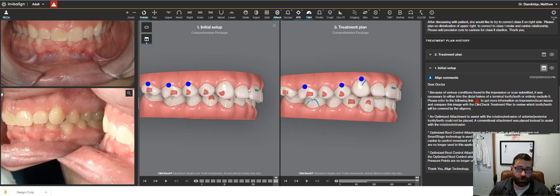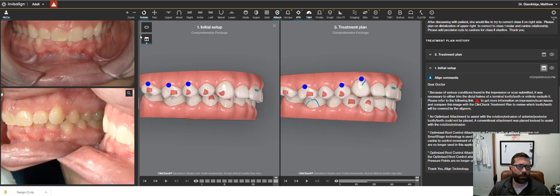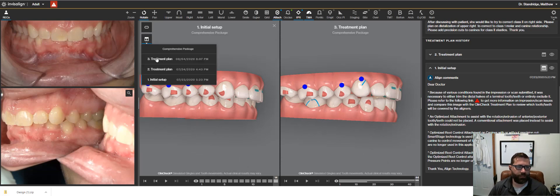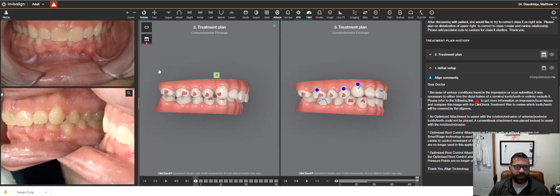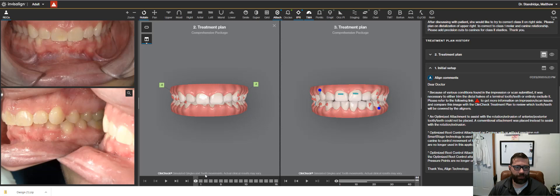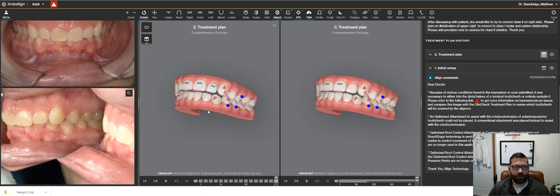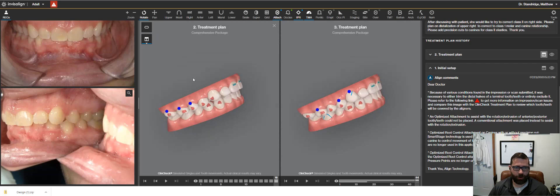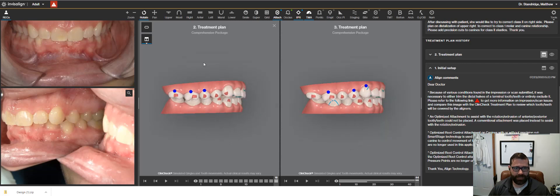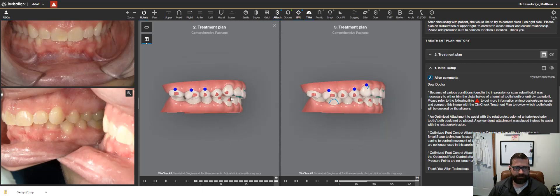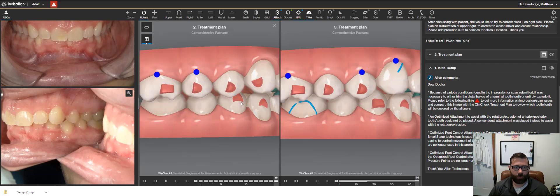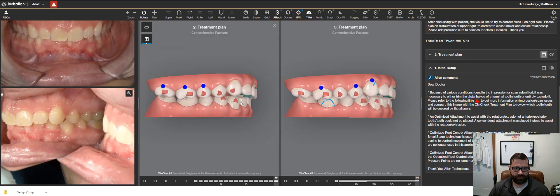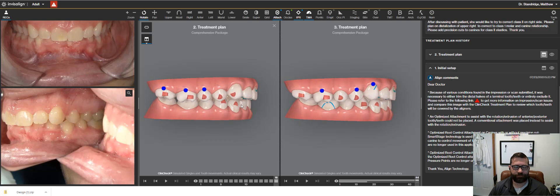So I went through a couple of clinic checks and we opened the bite more here, we opened the bite more, but it left her with even more overjet, right? After I asked to go to a zero millimeter overbite, the overjet was excessive.